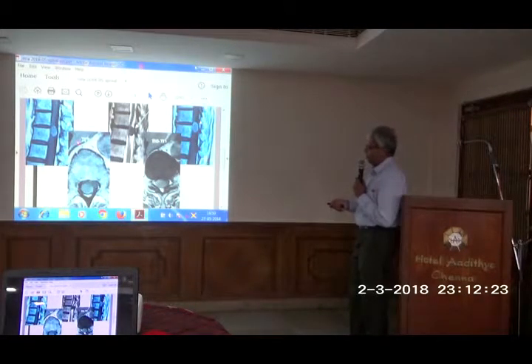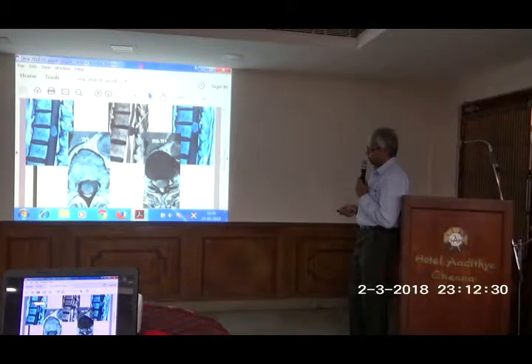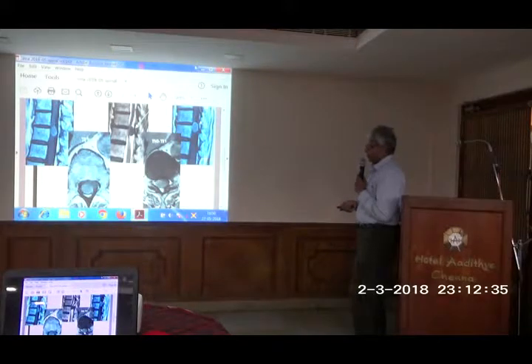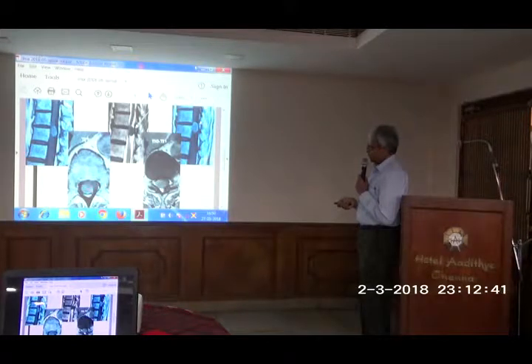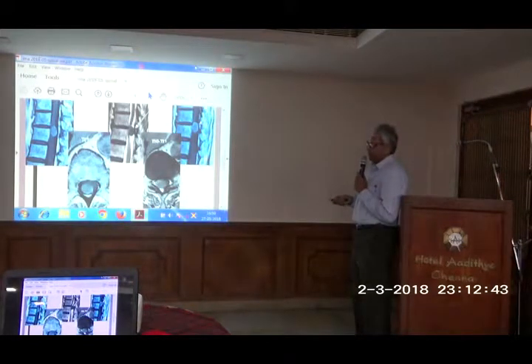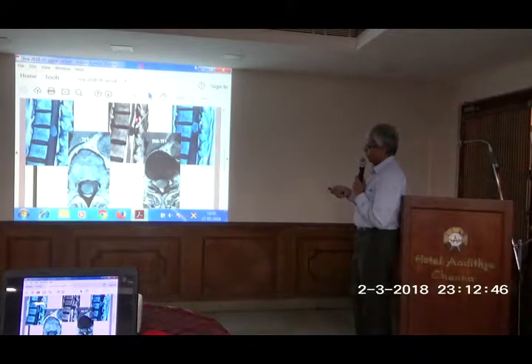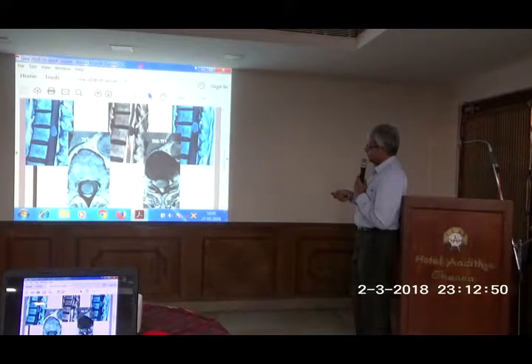This is an axial view. The level is marked — T level. Now this is the spinal bony canal. Posteriorly you see a white area. This is a T2 picture, so the fluid is white. This lesion which I am trying to show you is inside the spinal canal — intradural. Why intradural? Here you see this white area is CSF. The black area is the spinal cord.